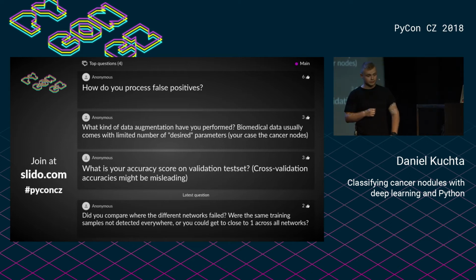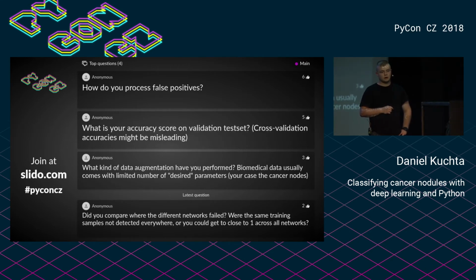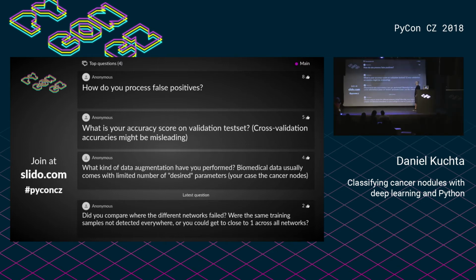The third network was nothing special, it was a 3D ConvNet, but again, we haven't used some publicly available architecture for that. We, again, just experimented with 3D layers in Keras, and tried to come up with the best architecture ourselves. Just a lot of trying and some common sense, how you stack the layers one after another. All right, thanks.